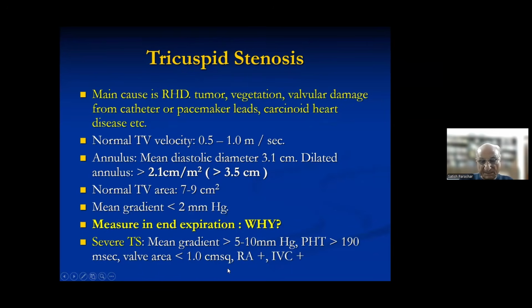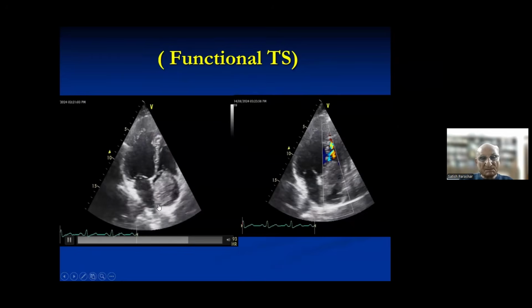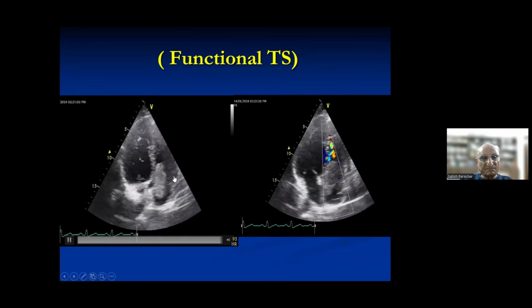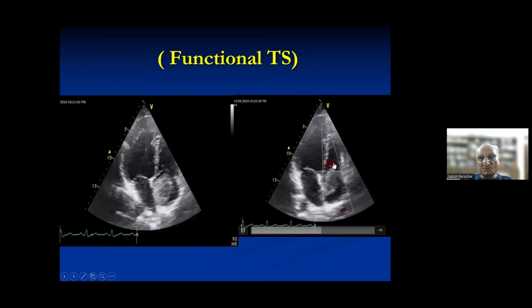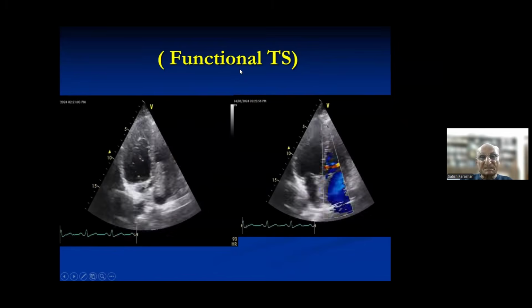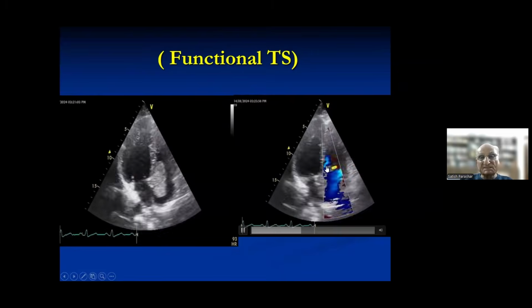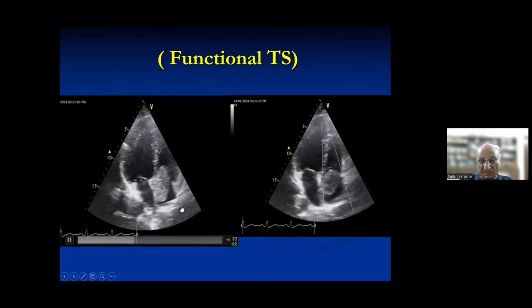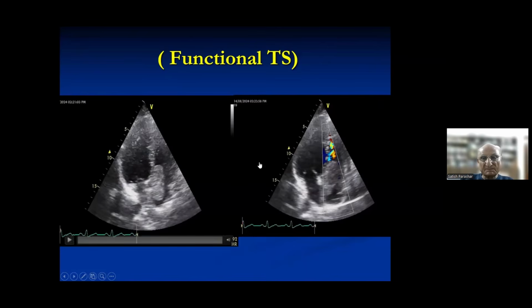And what you see here now, just giving an example. This is a right atrial myxoma. It goes through the tricuspid valve, produces a bit of turbulence, producing a functional TS. Why have you written functional TS? Once you remove the myxoma, this will tend to disappear. So just to tell you that we have shown one cause as a tumor which can be seen. So any valvular damage can also lead to this.